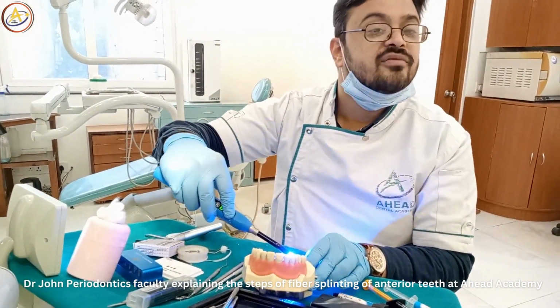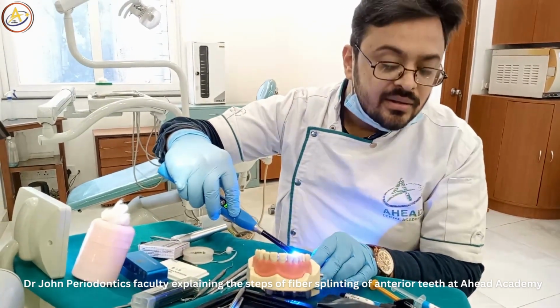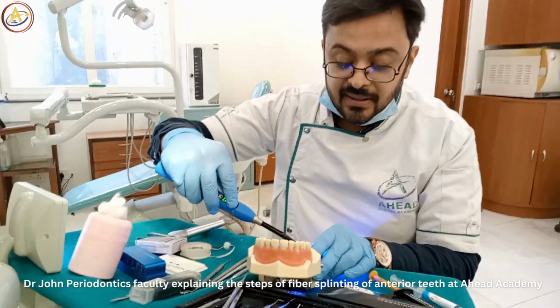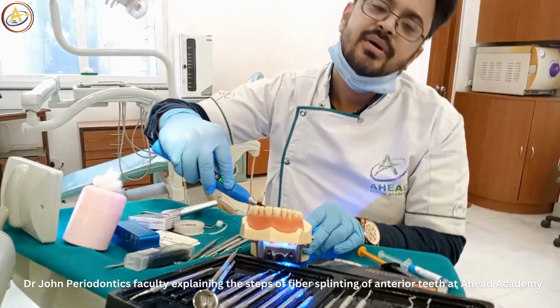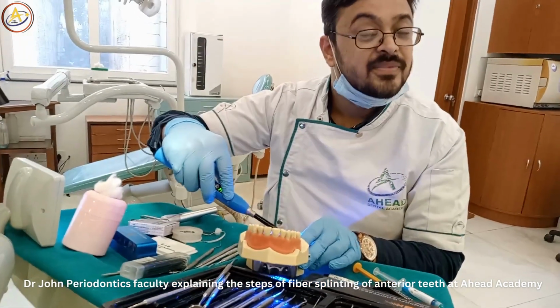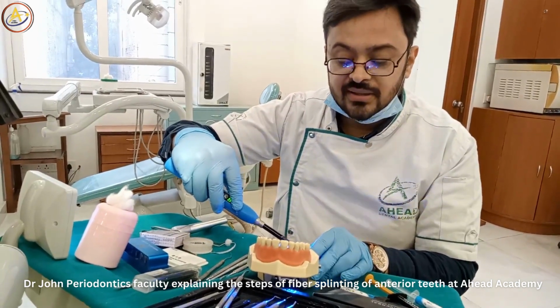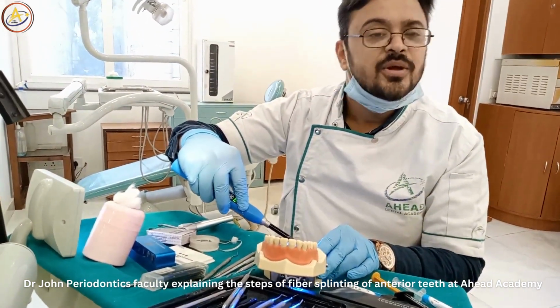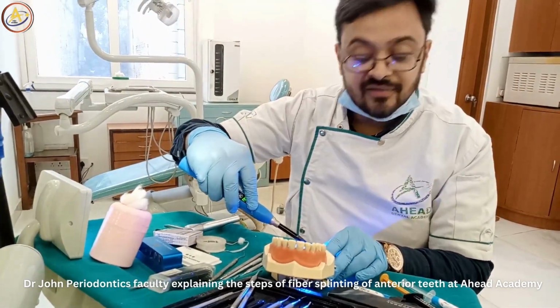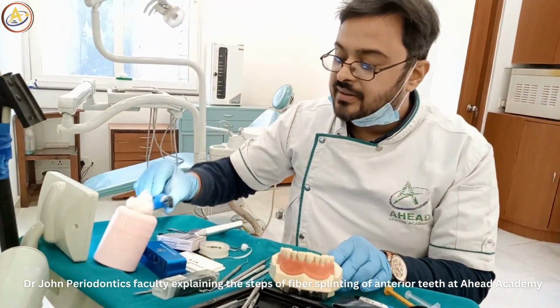Now it is your choice if you want to do fiber splinting, based on how mobile the tooth is, or if you want to do the composite splinting. And in the end, curing, shaping and trimming is very, very important. Always remember. Check the occlusal contacts, the coronal part, the gingival part. It is not creating interference. And then when you think that composite is perfectly fine, you can cure it. We'll see after this curing that if there is some high contact, we'll try to trim it.